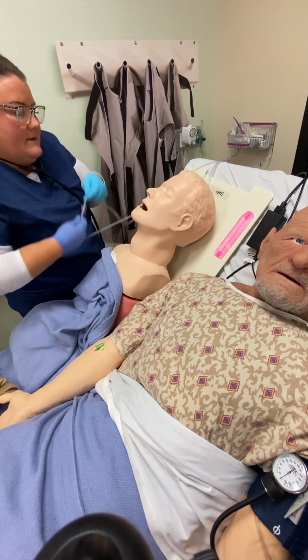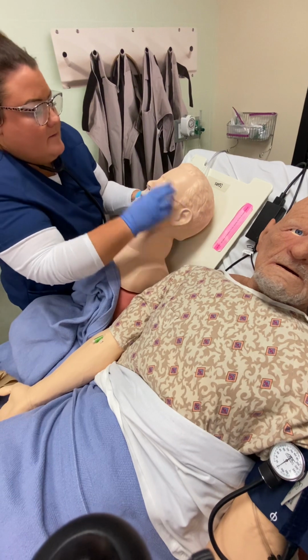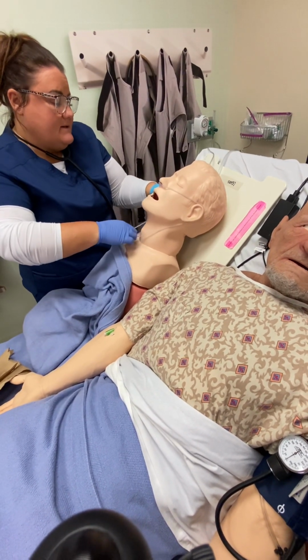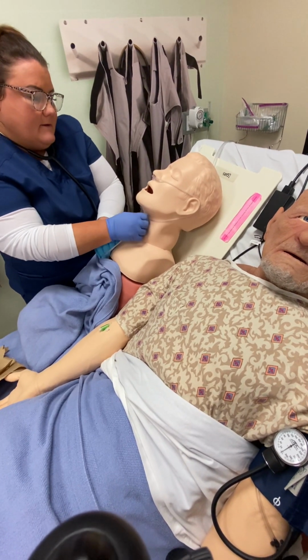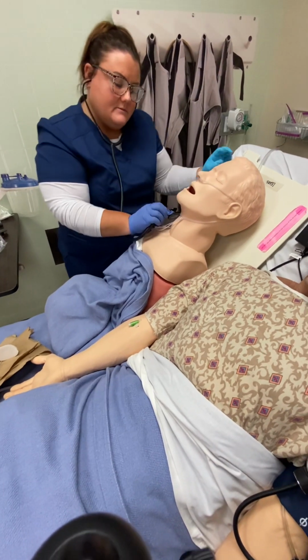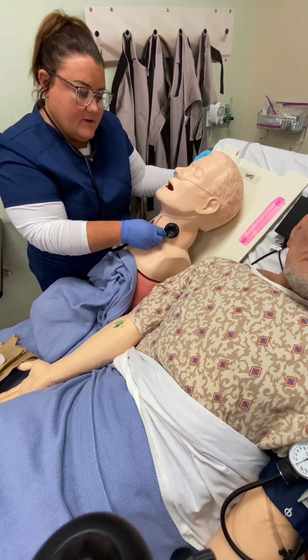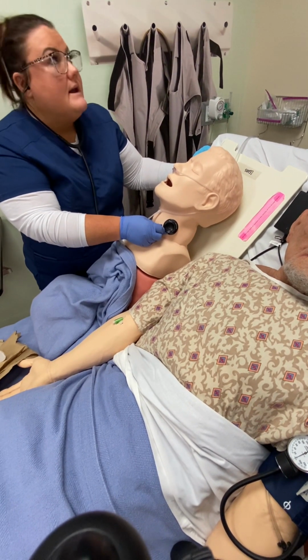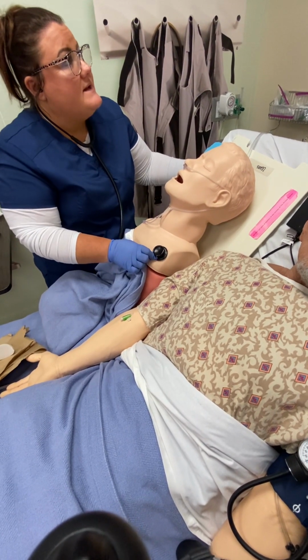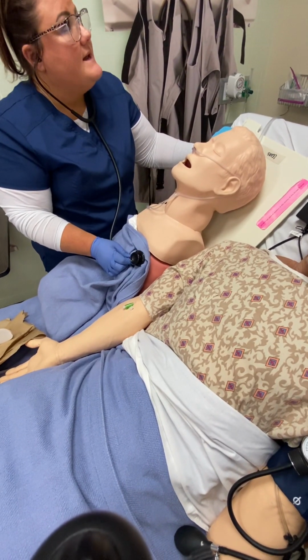Okay, can you tell me your name? Okay. And can you tell me where you are? Okay, take some nice deep breaths for me with that oxygen. There we go. Great, okay. So now I'm just listening for any stridor. Make sure that he sounds good. Okay, and I'm going to listen to breath sounds. And I'm checking the monitor while I'm doing that. So I'm looking at my heart rate, my respiration rate, my SpO2, my blood pressure, and my EKG.